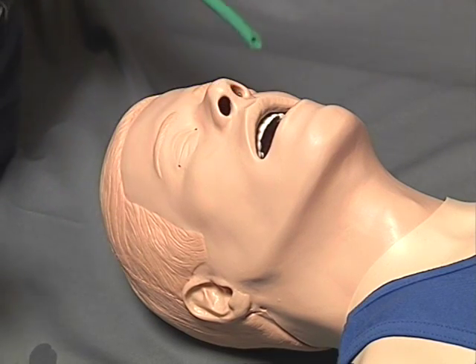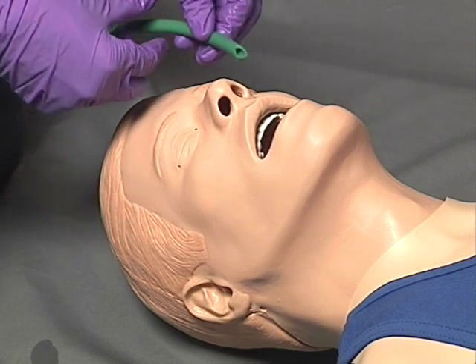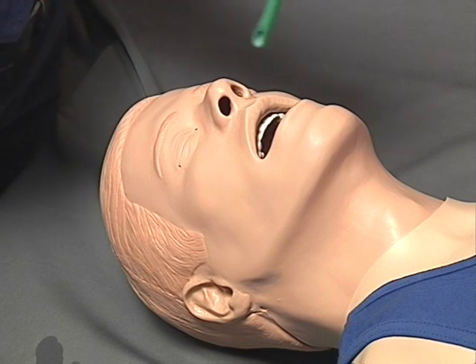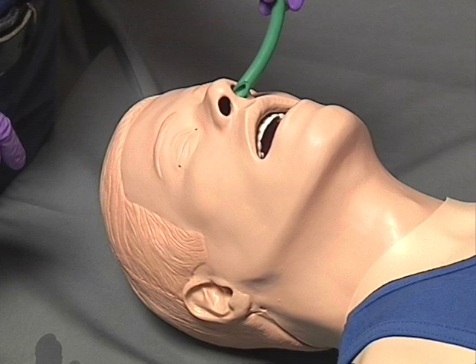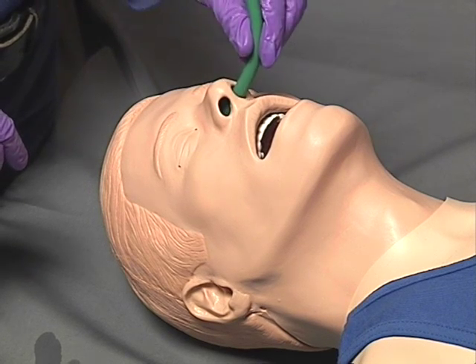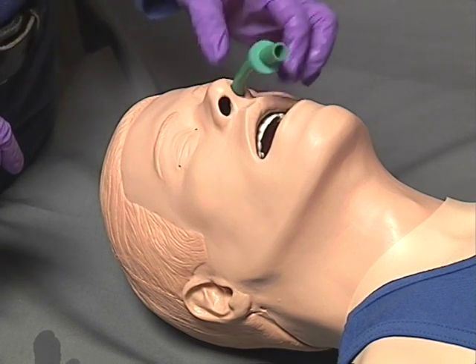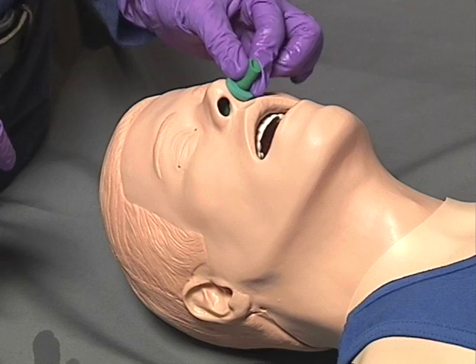If inserting the nasal airway into the patient's left nares, it is necessary to invert the airway so the bevel of the airway remains along the septum. Once the nasal airway reaches the nasopharynx, rotate the airway 180 degrees to resume alignment with the normal anatomical curvature of the nasopharynx.